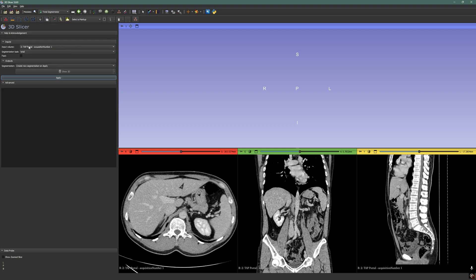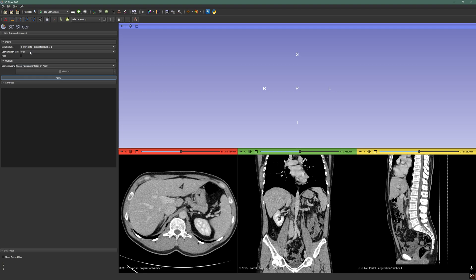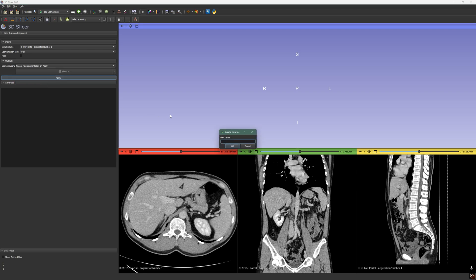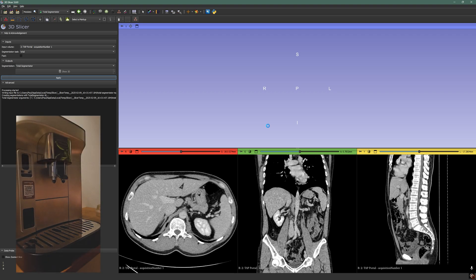You need to check the input volume and the segmentation task. Usually I just go for 'total', but it depends on what you need to do. You can click 'fast' if your computer is slow, but the result risks being less accurate. In outputs, you can create a new segmentation — call it TotalSegmentator for example — and you just need to click Apply and let the software run. To give you an idea of how fast this is, I'm going to make myself a coffee while the software runs.